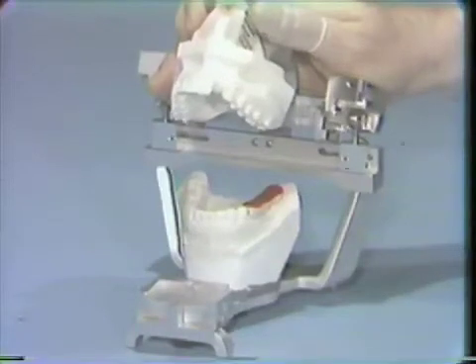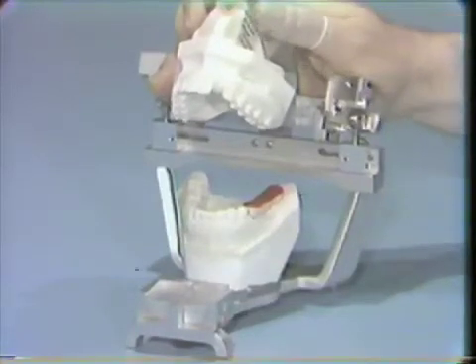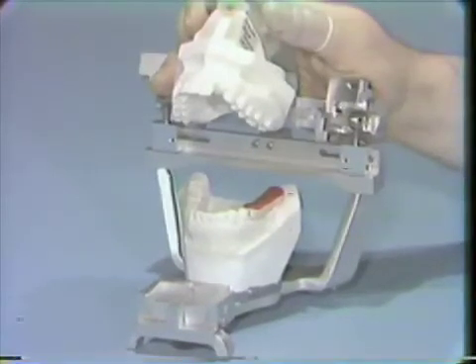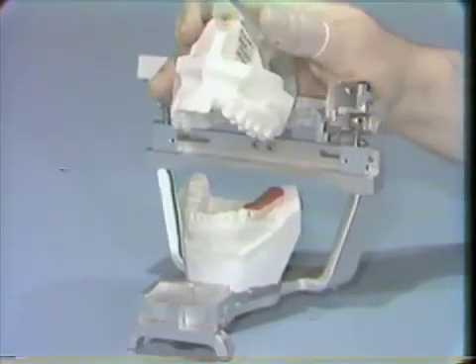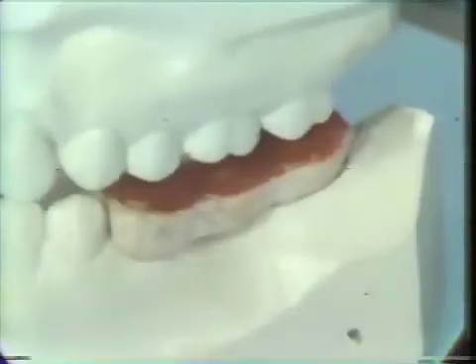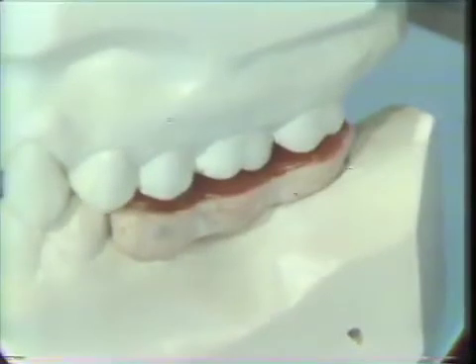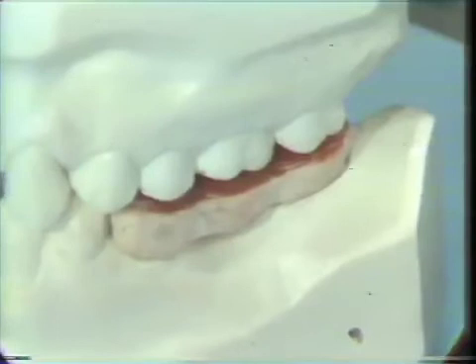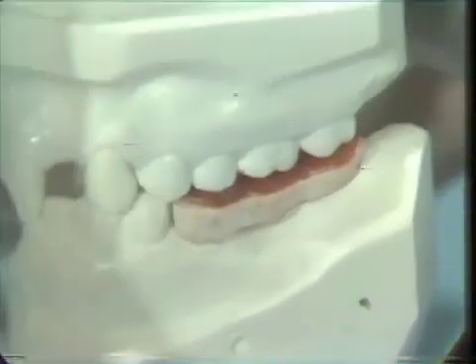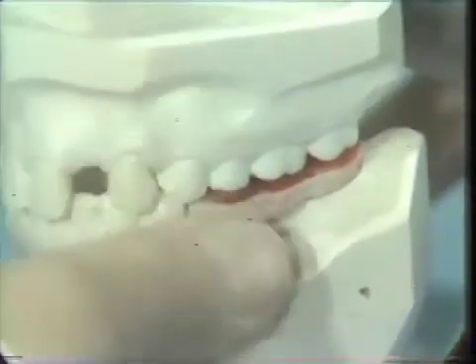We've placed it into the patient's mouth, and we would normally allow the cementing medium to harden. And then we would instruct our patient to close, in this instance, in centric occlusion. And if the dentition had been adjusted to a long centric, we would move them from centric occlusion to centric relation, and then through the lateral excursions, and first to the right lateral and then to the left lateral.